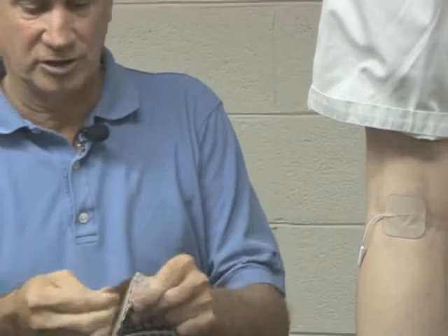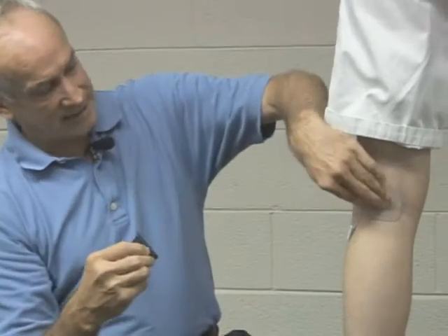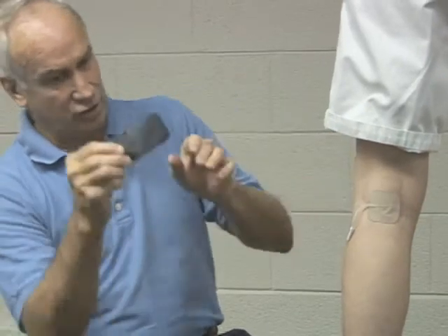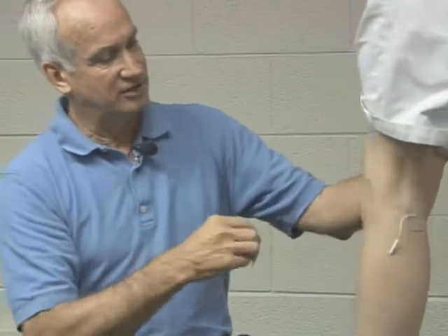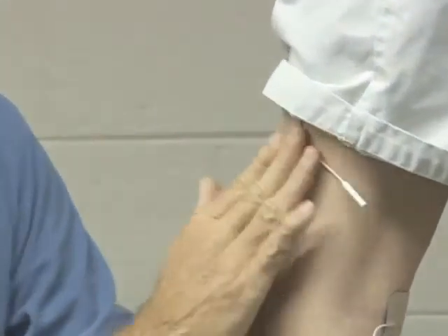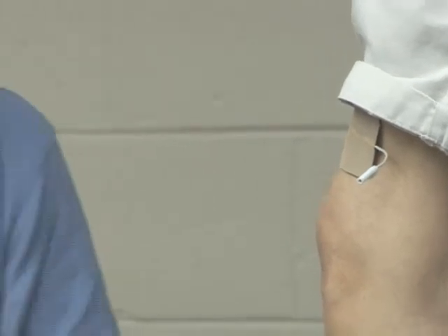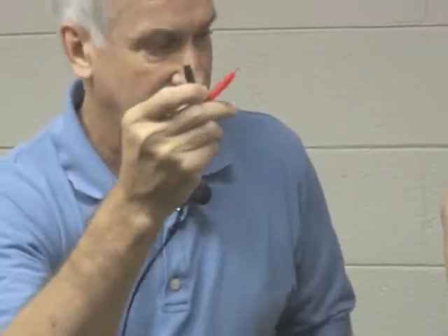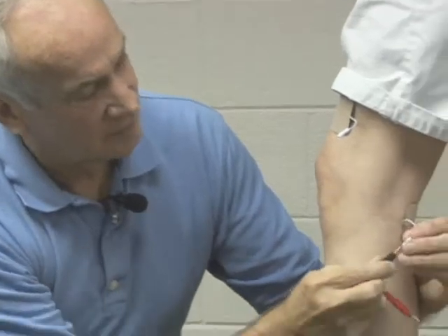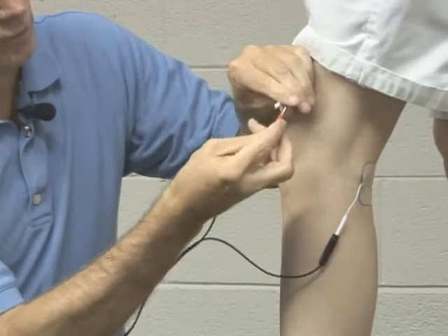I would probably take a larger electrode because all I'm trying to do now is have the electricity come out and go toward this electrode. I'm going to put it up here where there's a little bit of muscle — there's more water there. So now I'm adjusting this, taking my cables, putting one in here and one in here.